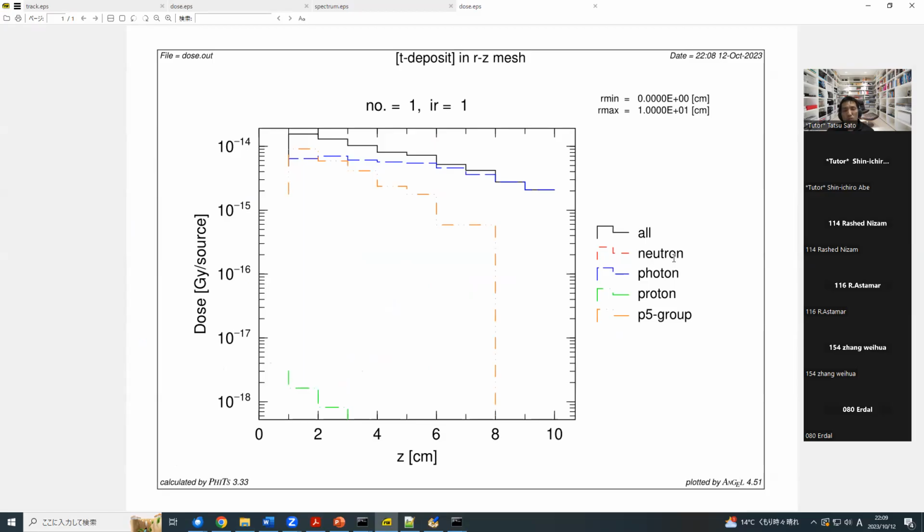because, so people usually say neutron dose, but the term neutron dose is sometimes a controversy because neutron itself never deposits energy to a material. Always secondary particle, charged particle deposits energy. So if you turn on the event generator mode, secondary particles are explicitly generated. So in that case, neutron dose becomes 0, and the charged particle always deposits energy to a material.